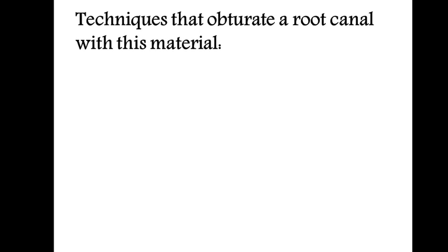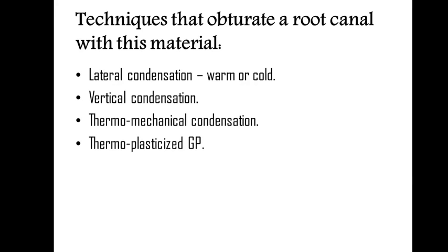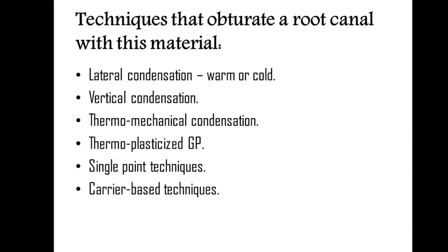Techniques that obturate a root canal with this material are lateral condensation, which could be warm or cold, vertical condensation, thermomechanical condensation, thermoplasticized gutta-percha, single point technique, and carrier-based techniques. Okay, so these are the techniques that obturate the root canal with this material.